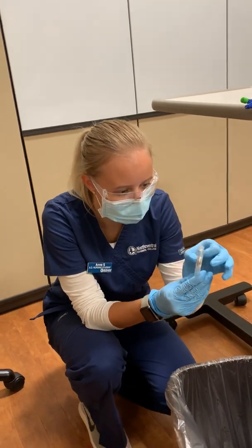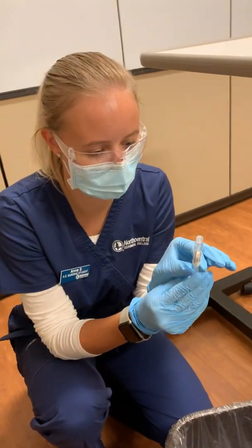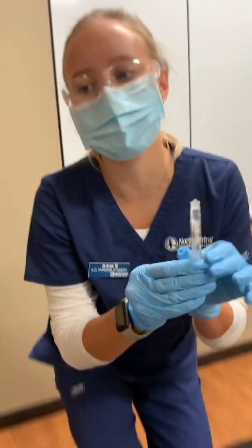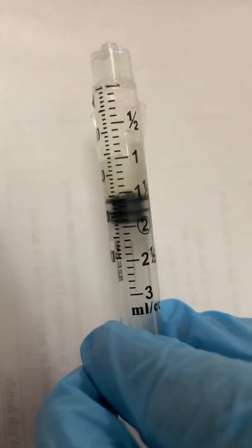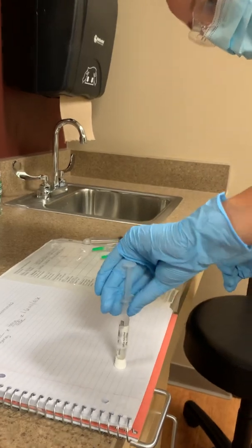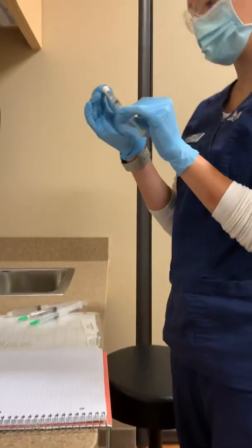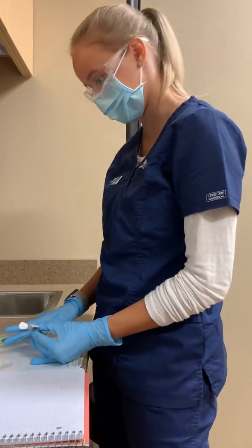Okay, so I have 1.6 milliliters in here, and I would get all of the bubbles out. Check it. Alrighty, and then I would recap the syringe. And since I'm dose accurate, now I can do my 5 rights 3 times.